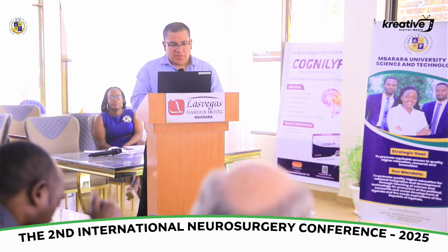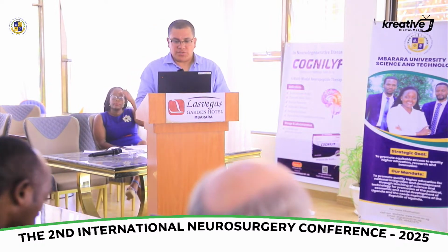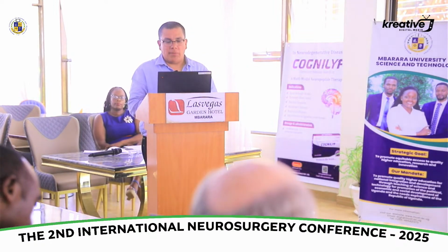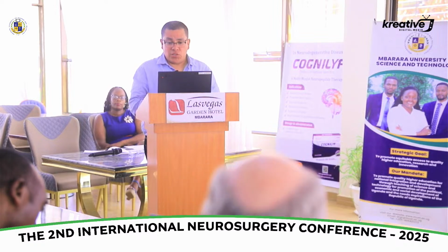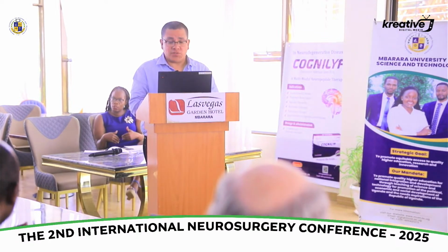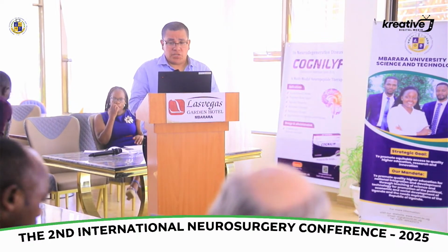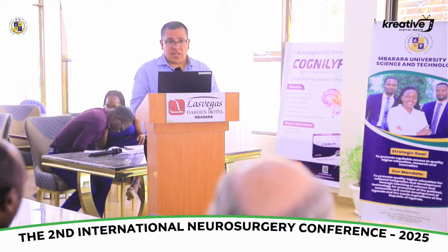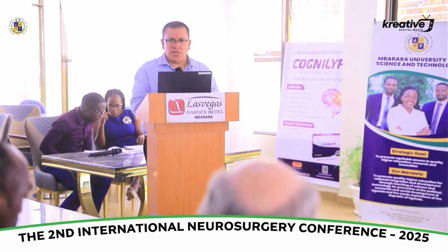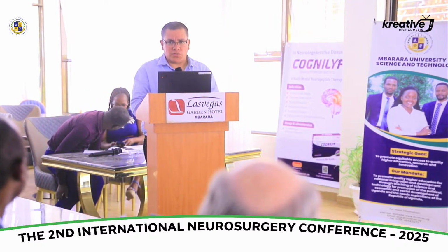So let's talk a little bit about the intracranial vascular anatomy with ultrasound that I think is really useful. The main modality that we use in the ICU at our institution is transcranial Dopplers, and we use it mostly for the determination of cerebral vasospasm. Looking at your machine last year, I saw that there is a setting for TCDs, so depending on how many hertz we can actually use, maybe we can do a demonstration when we are in the hospital.